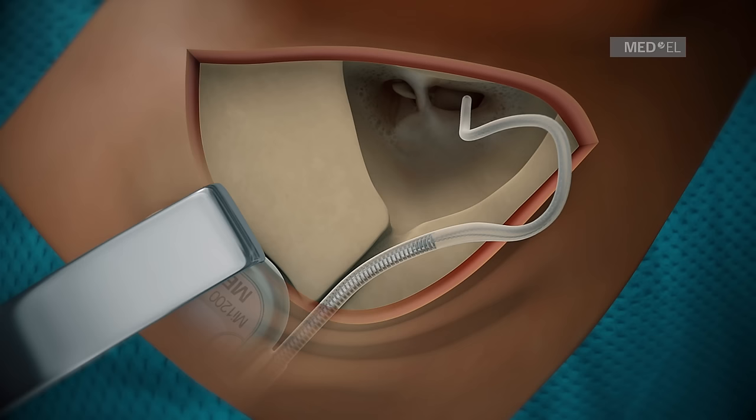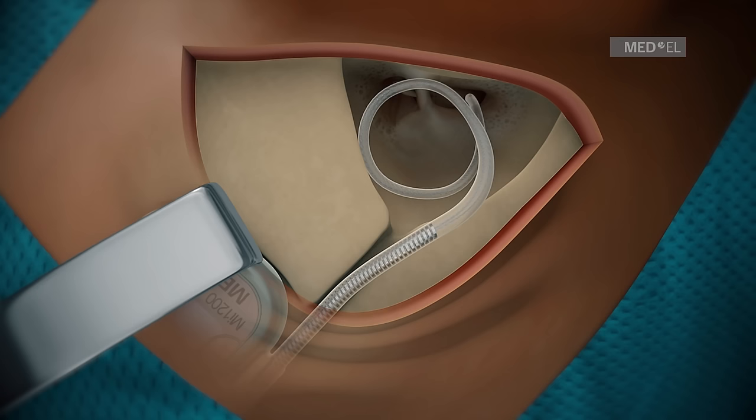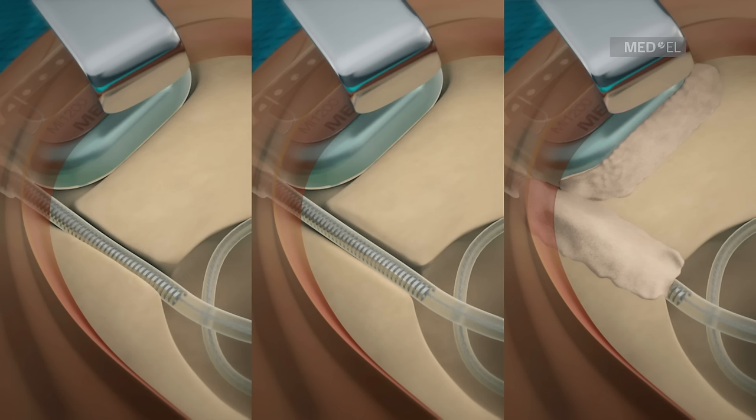Step 5: Electrode Lead Placement. After electrode insertion is completed, the extracochlear electrode lead can be looped against the wall of the mastoid cavity and hidden underneath the mastoid overhang. Place the electrode lead into the drilled electrode channel. A narrow electrode channel with overhang, or a half-bridge technique, are also optional.